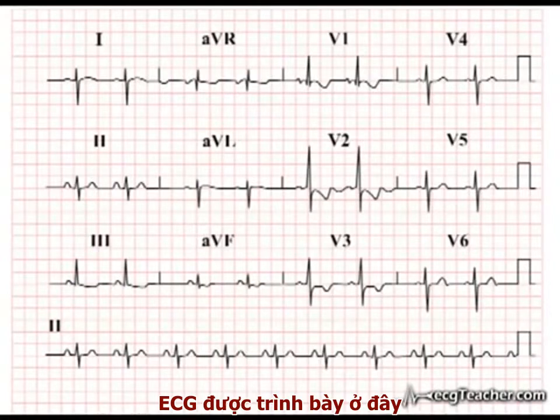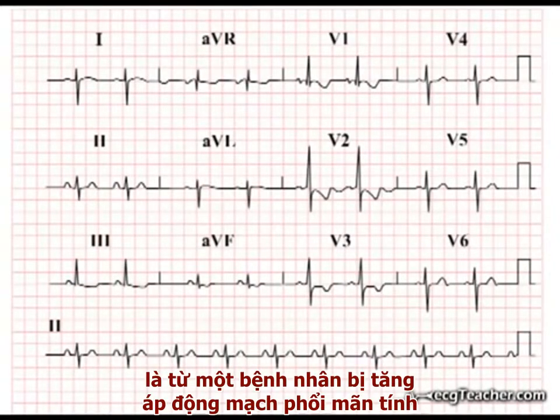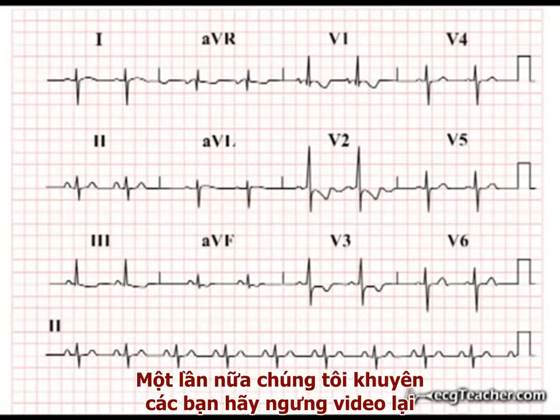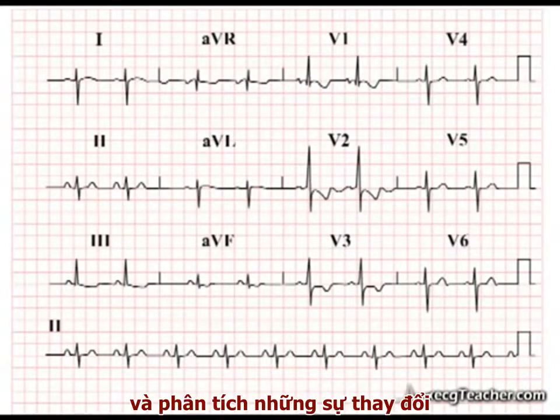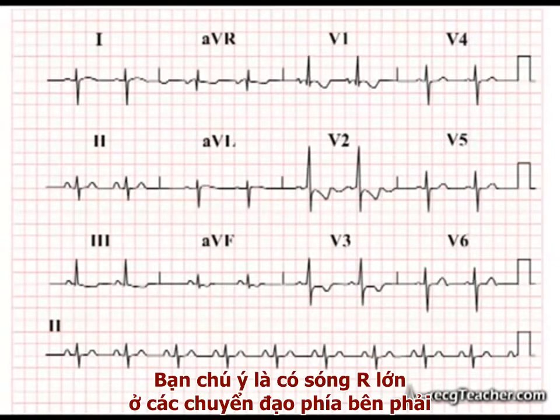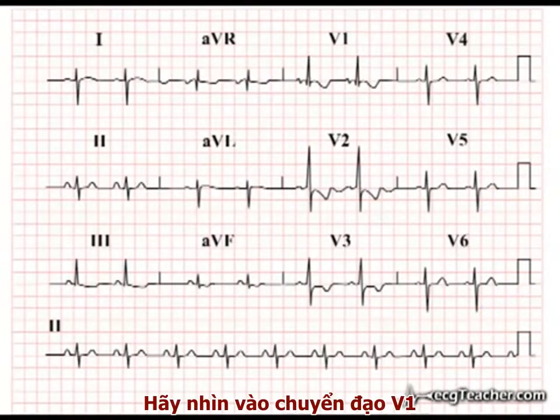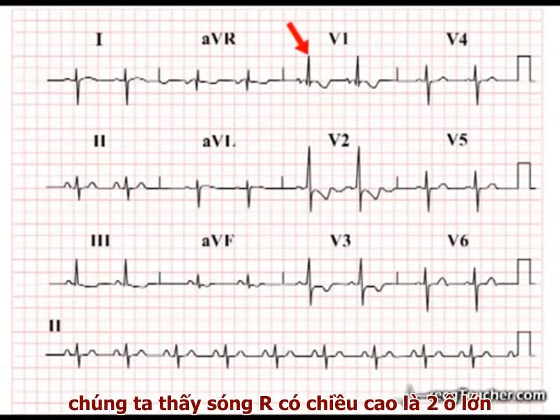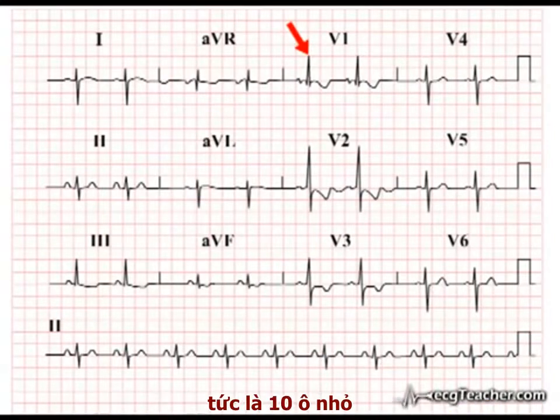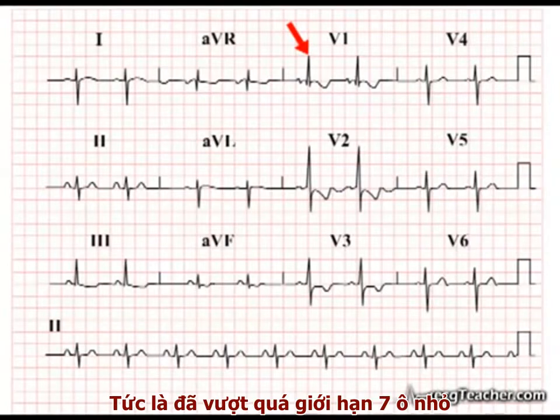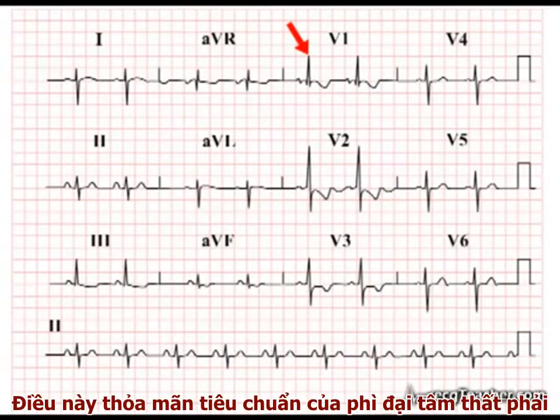The ECG shown here is from a patient with chronic pulmonary hypertension. Again, we would invite you to stop the video at this point and analyze the changes present. You will notice the prominent R waves in the right-sided chest leads and significant S wave activity in those on the left. When we examine lead V1, we find that the R wave is two large squares in amplitude, or ten small squares, well above our limit of seven small squares. This is consistent with underlying RVH.